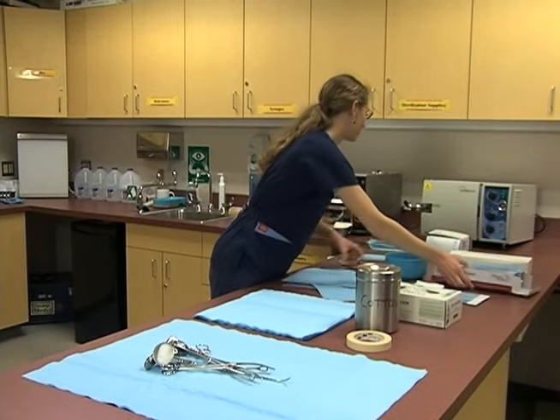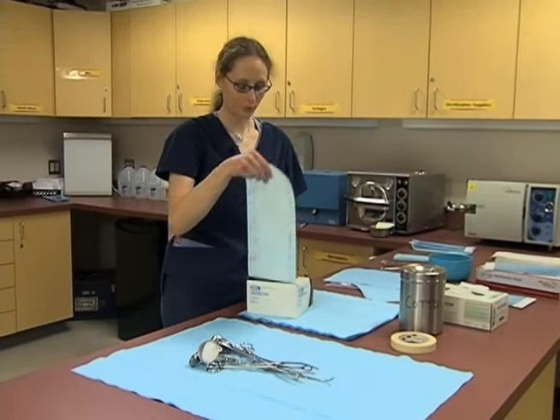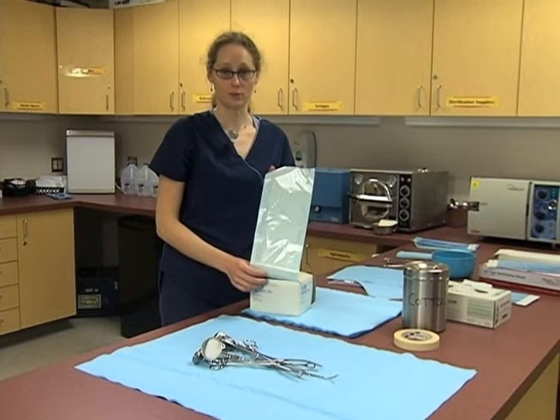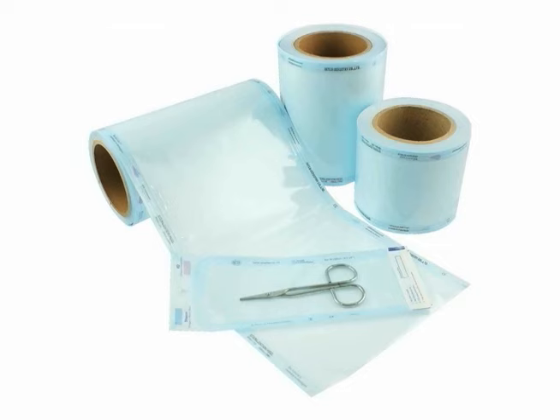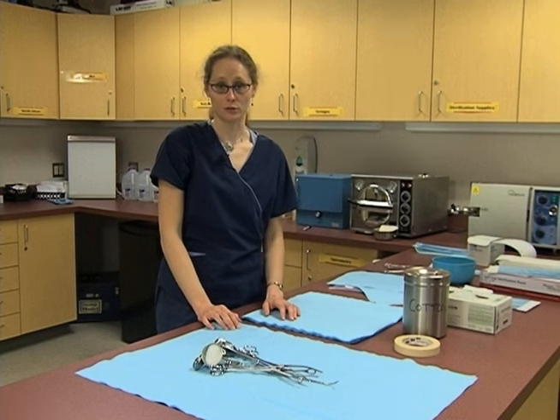There are also a variety of pouches available. So some come already pre-made with a size, others come in a roll, where then we can customize the size that we need, and we cut it and use tape to secure the ends when we're done. So I'll be showing you how to wrap tools first, and then we'll look at how to put instruments into a pouch.